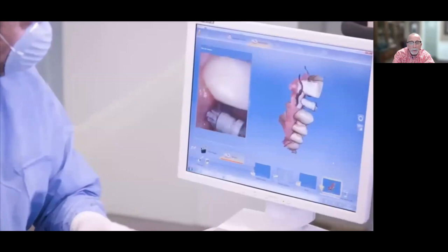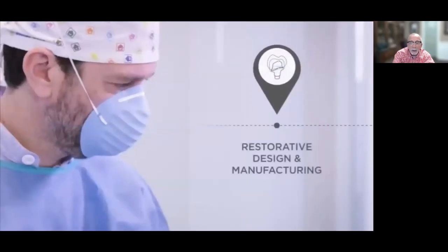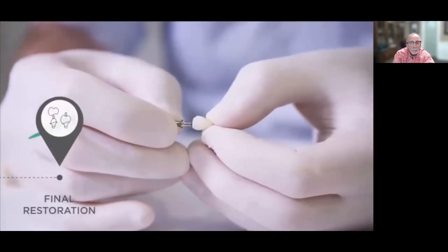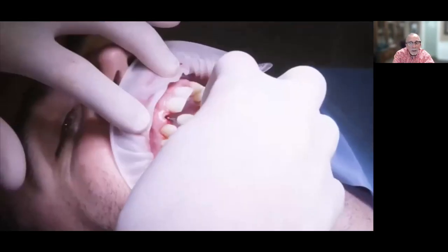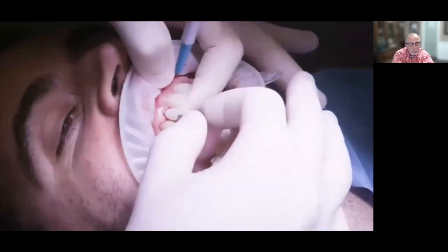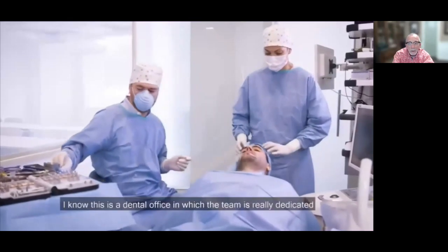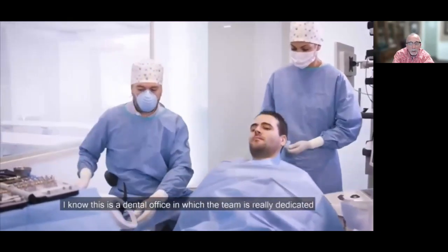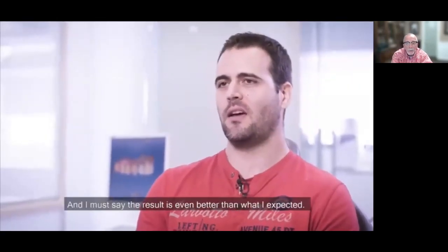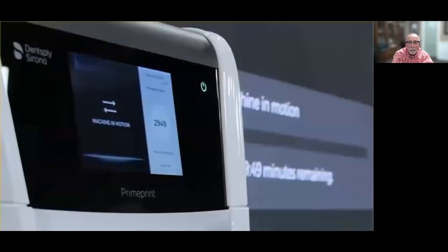At some point, though, we're going to scan, right? Once everything's done, we're going to put the scan post in the implant. And then we're going to take that data over to our software. We're going to design the final restoration and then deliver. So in reality, this can be done in 3 or 4 appointments in a relatively short period of time, depending on the healing of the implant. Because we customized everything from the plan forward, the result is good. And that's what we're looking to do. And that's the beauty of digital.